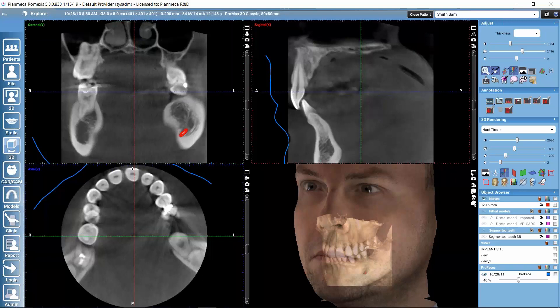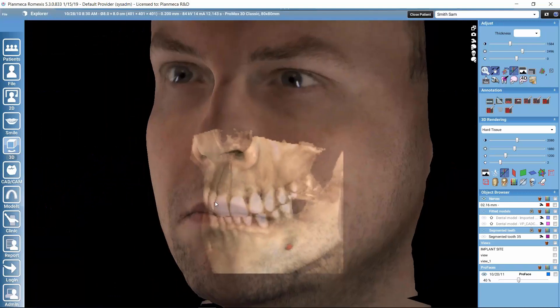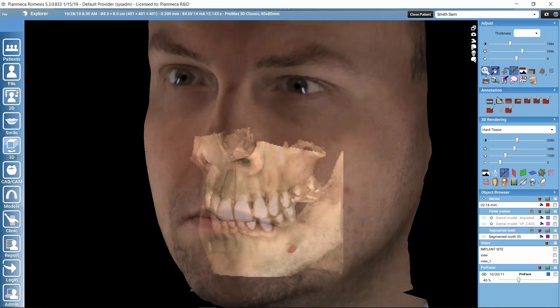Let's take a look at a couple of controls available here, as well as in the other views. This 3D rendered view can be maximized to the whole image viewing area using the first button, or minimized back. If we would like to get a 2D image of what we see, we can use the camera icon — a 2D image will then be saved in the 2D imaging module for the patient.